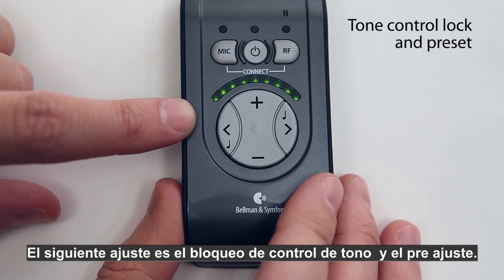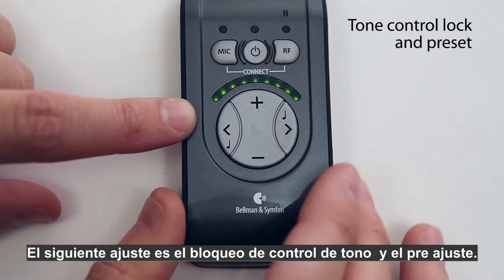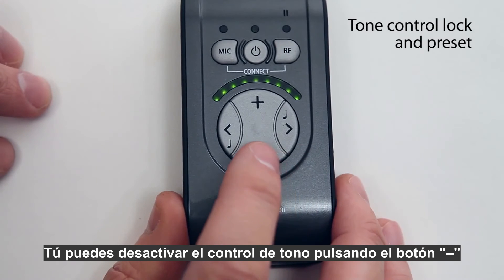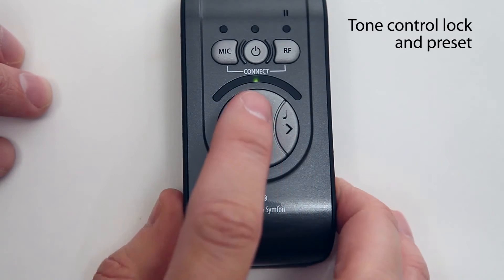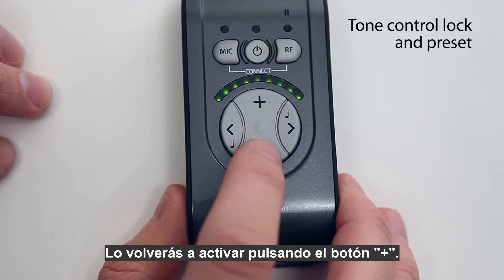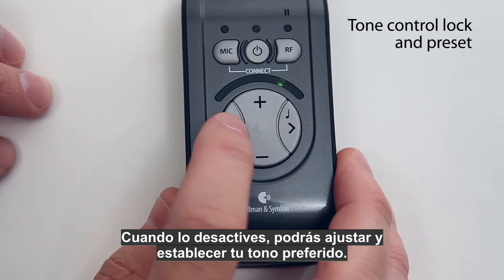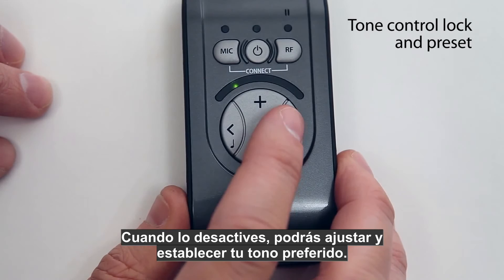The next setting is tone control lock and preset. You can deactivate the tone control by pressing the minus button and activate it again by pressing the plus button. When deactivated, you can also adjust and set your preferred tone setting.